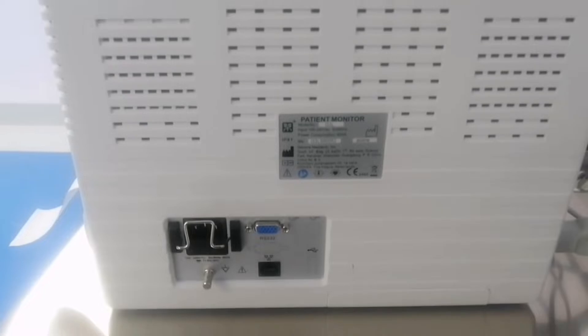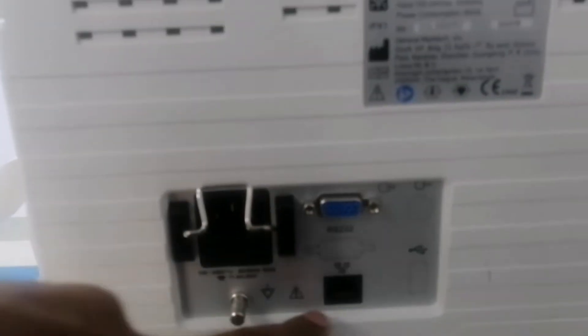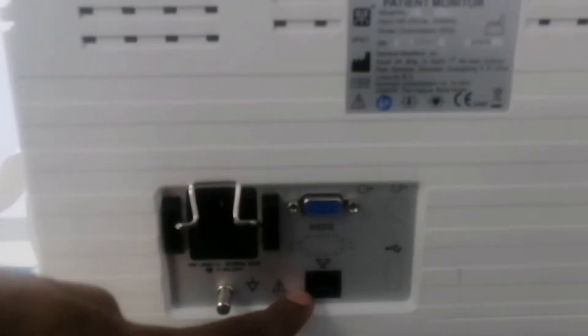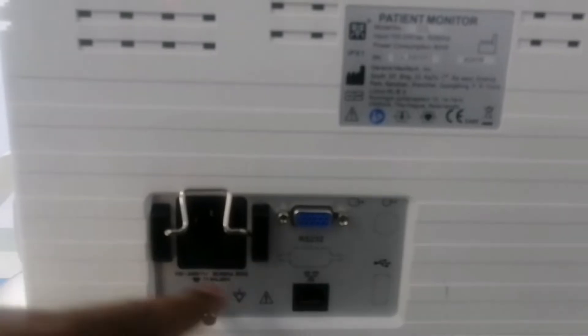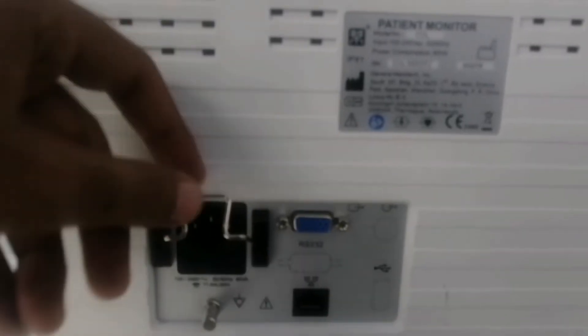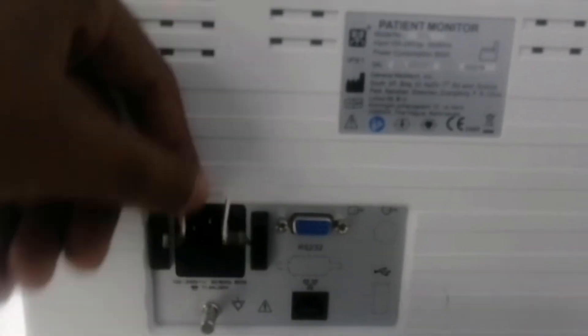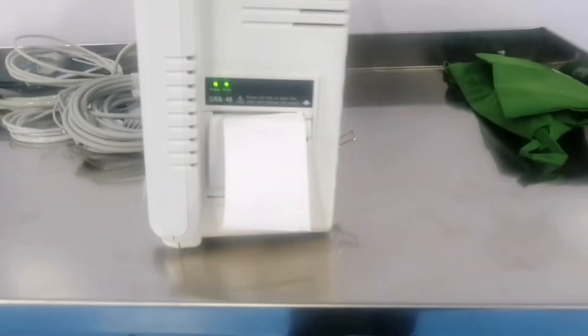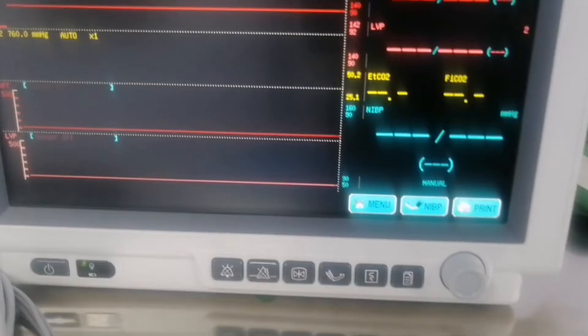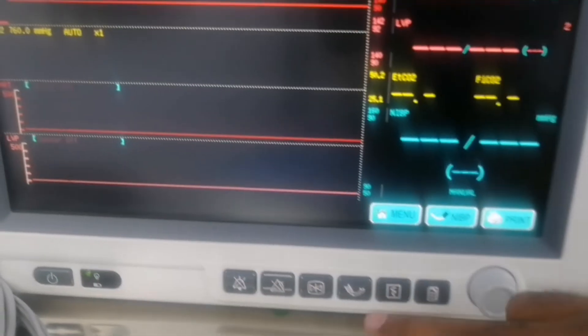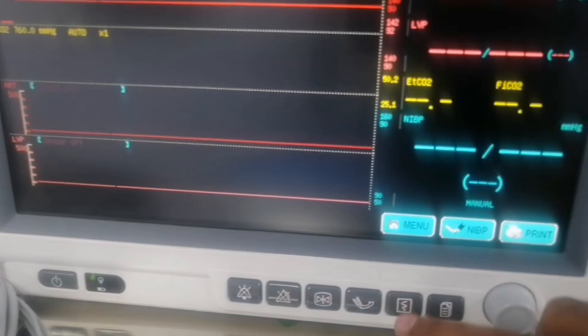This is the back of this monitor. Here is the networking port which we will use for networking or central monitoring system. Here is the power cord and on the right side is the printer which shows the ECG. I just press the ECG and the ECG waveform prints out.